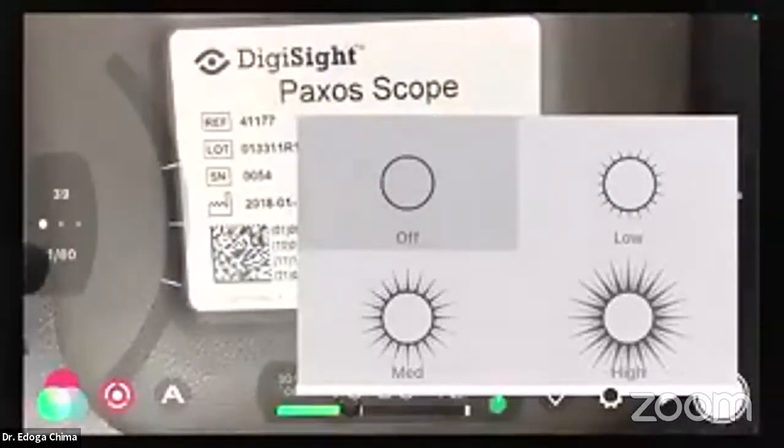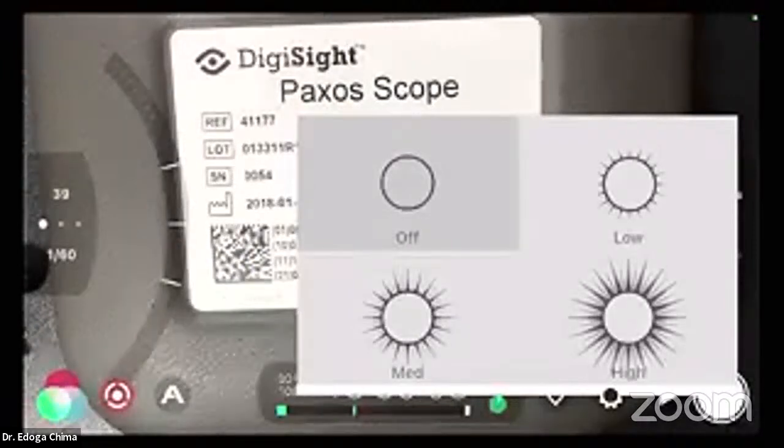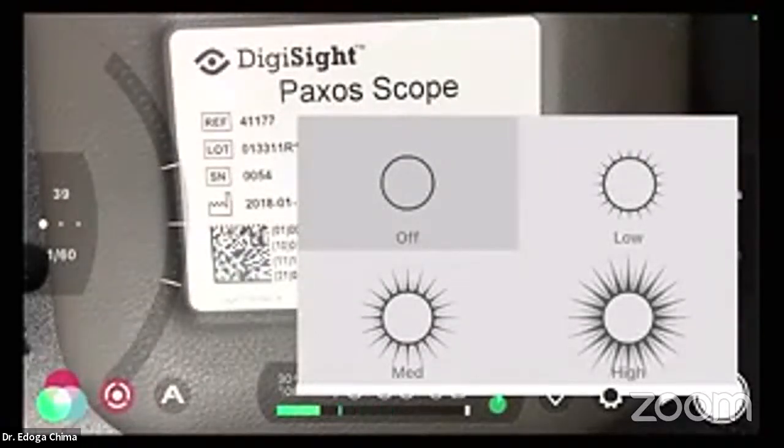For iPhone, there is the function of choosing low, medium, or high. But if you're using an Android phone, you may not have that functionality. So Dr. Oloye developed a technique where he used a sellotape, a masking tape, those paper type of masking tapes, where you use one layer on top of your flash.